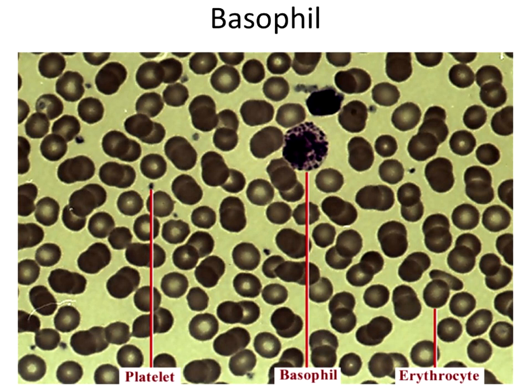The next type of formed element we'll look at is another granulocyte called a basophil. Basophils are really kind of nondescript — they kind of look like somebody stepped on a bunch of grapes. Their nucleus does not have a nice defined bilobed nucleus like the eosinophil we just saw, but it definitely still has all those little granules. The basophil just looks like a bunch of stuff stuffed inside it.